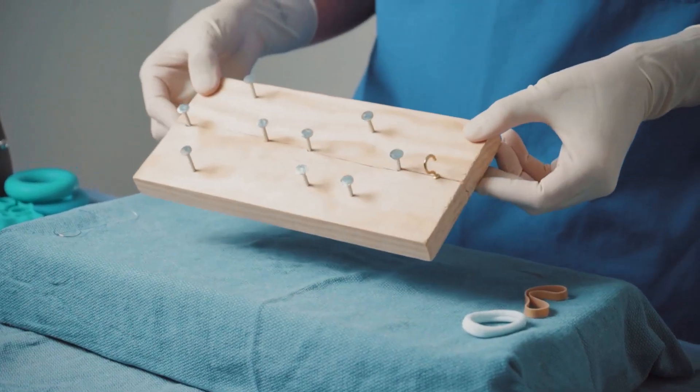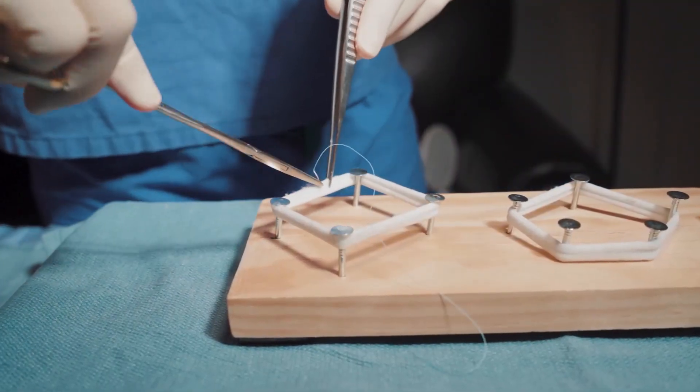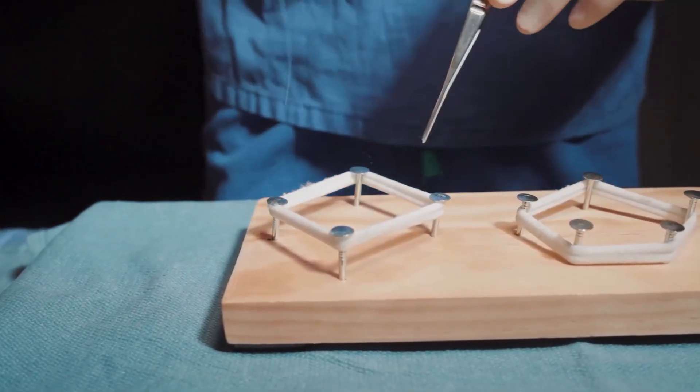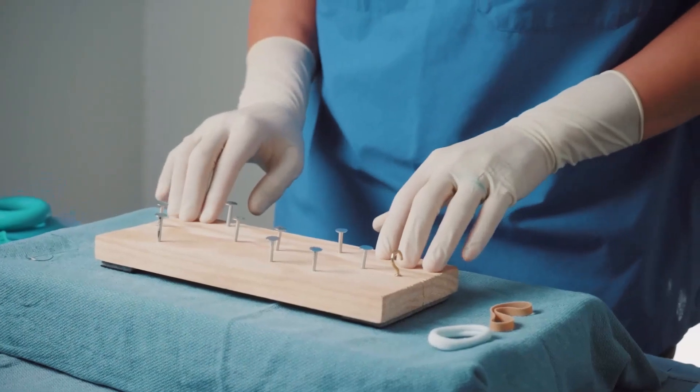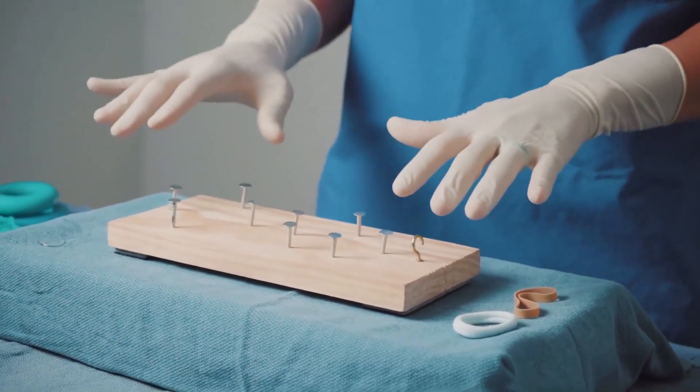We eventually settled on something like this — and it doesn't have to look like this when you make your own. This is just something that we thought captured all the needle angles that we wanted to work on. It's just a wooden board with nails built into it, so that it functions kind of like pegs on a pegboard with different shapes.